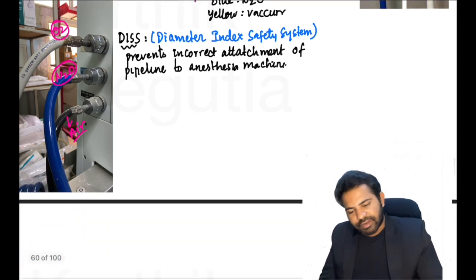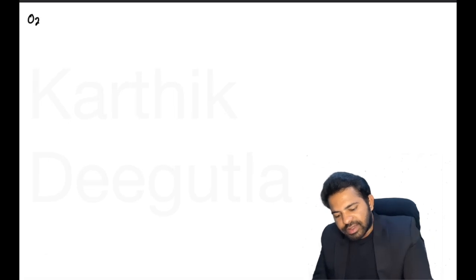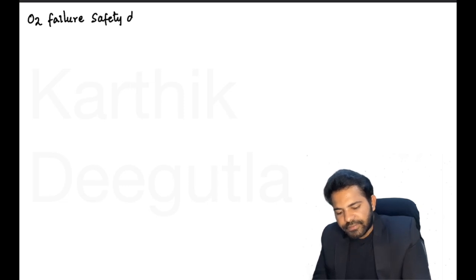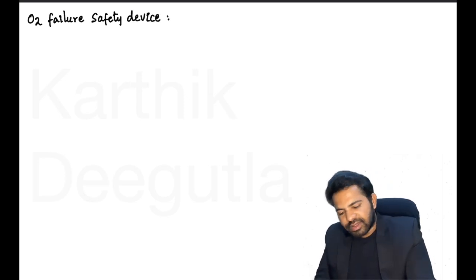Is this clear? Oxygen failure safety device. This is a safety mechanism to prevent hypoxia.